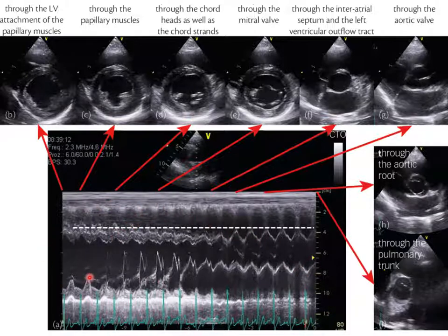It's great for measuring very precisely with super high time resolution certain things like myocardial wall thickness or whether or not a valve is moving at the right speed. And then this is the 2D image by sweeping that beam across the patient or the field of view.